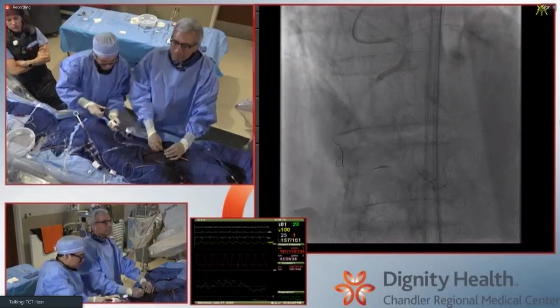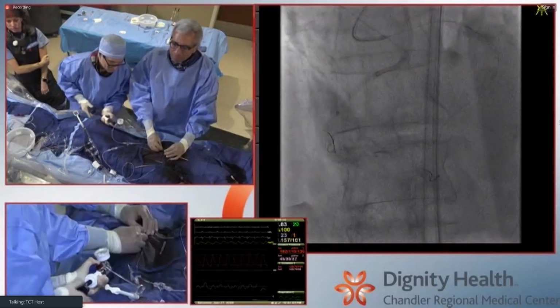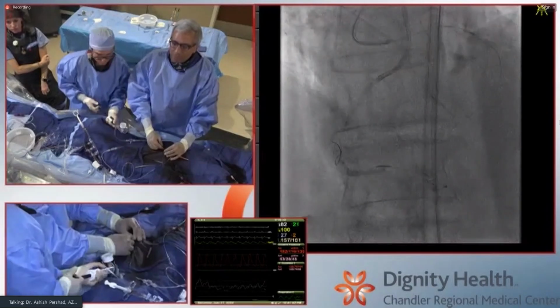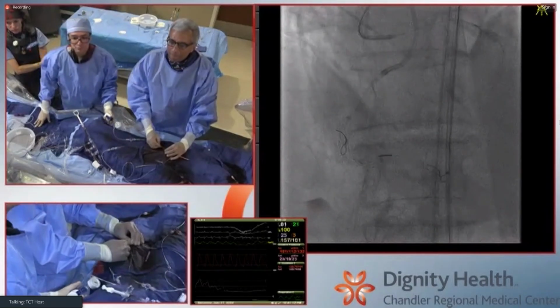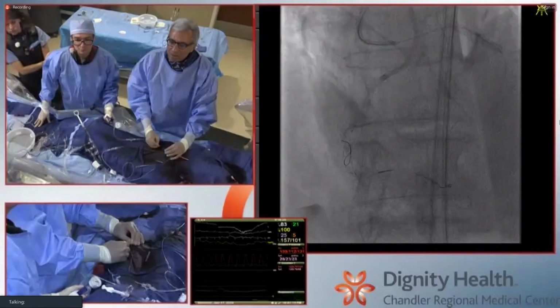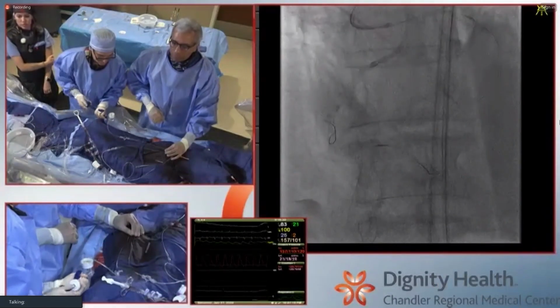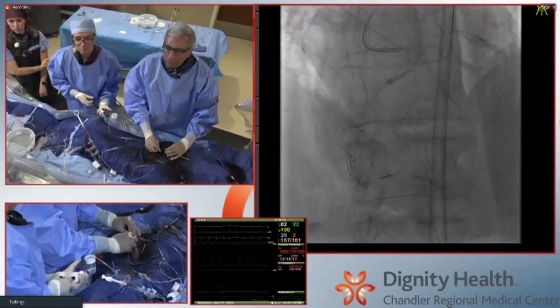I think it just speaks to the mechanism of action of these cutting balloons, where ductile materials will bend, brittle materials will crack, right? That's why they don't do anything to normal tissue, but within calcium they really do split things. I have a couple of cases last month where the Wolverine burst, with 2.5, even in such heavy calcium.